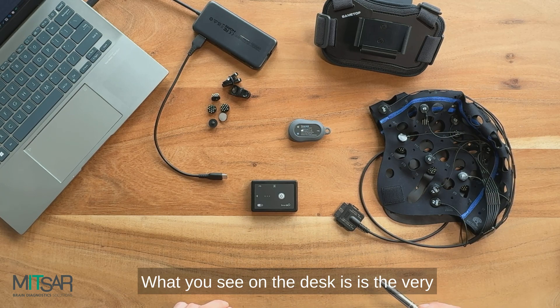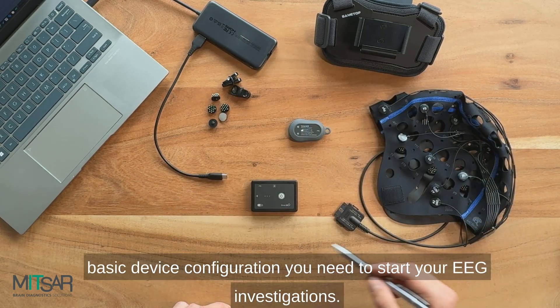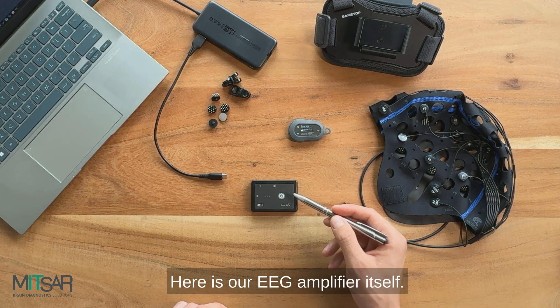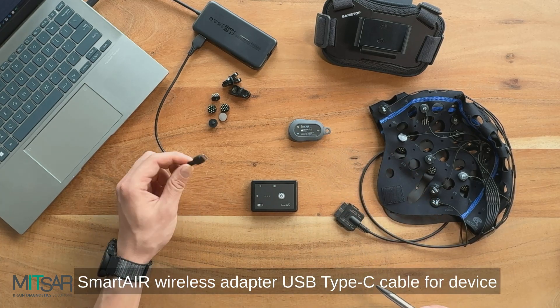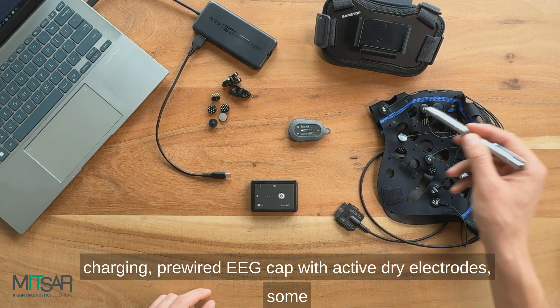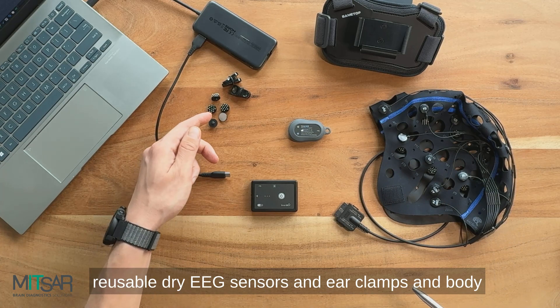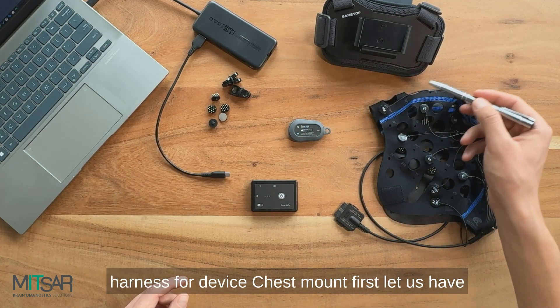What you see on the desk is the very basic device configuration you need to start your EEG investigations. Here is our EEG amplifier itself, Smart Air Wireless Adapter, USB Type-C cable for device charging, pre-wired EEG cap with active dry electrodes, some reusable dry EEG sensors and ear clamps, and body harness for device chest mount.